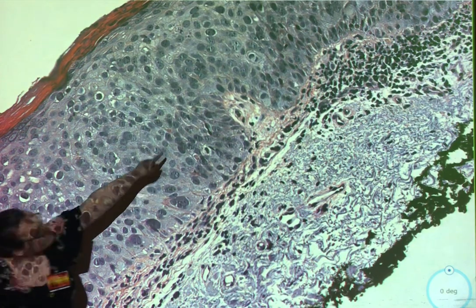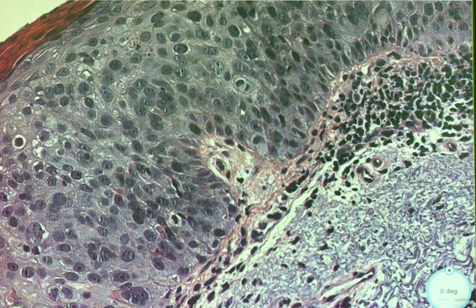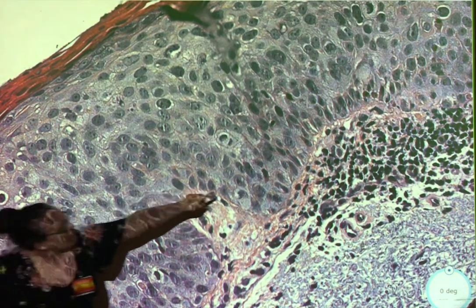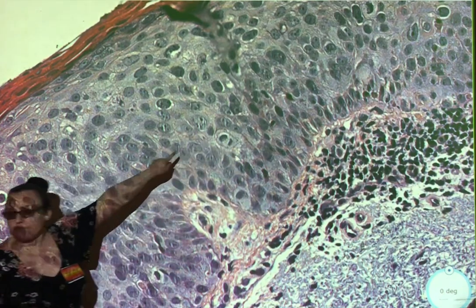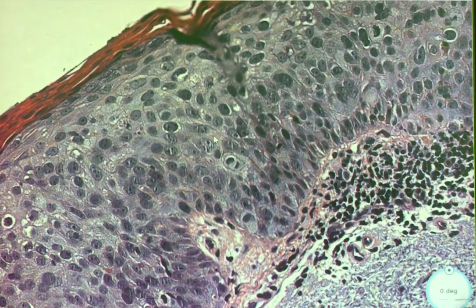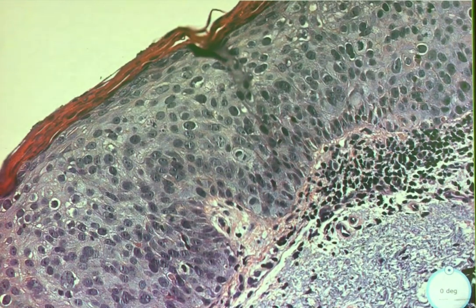Okay, well, I see something else that's interesting up here, that lighter cell. Right here? Yeah, what do you think is going on there? Is it the mitotic? I think it's a mitotic figure. What is it, metaphase? Metaphase. Or maybe anaphase. That's what it is. But look how high up it is. Are we supposed to see mitotic figures that high in skin? No, it's higher than it should be. So the skin isn't behaving too well. Right, it's being an individual. Not in a good way. So yeah, this is not a good sign.